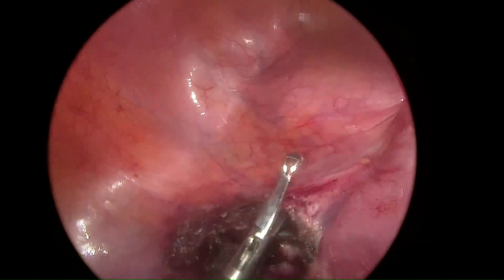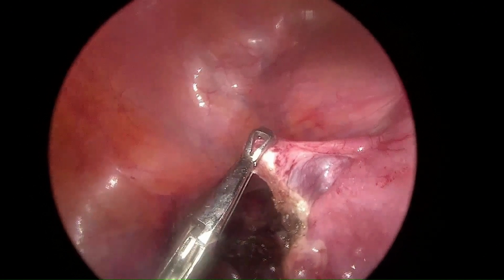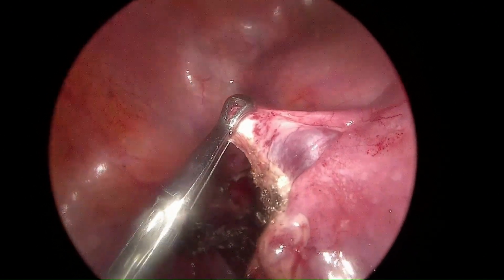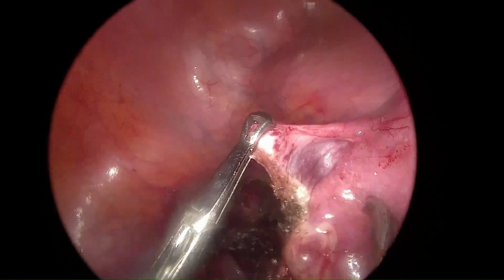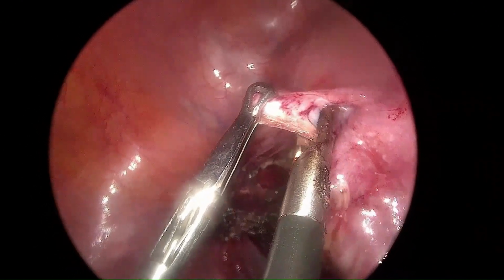Lift the uterus up and retrovert it so that bladder dissection can be easy. First, the cornual pedicles are detached. Once the round ligaments are cut, the two leaves of broad ligament are separated.